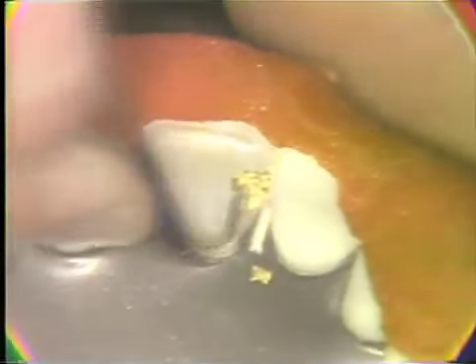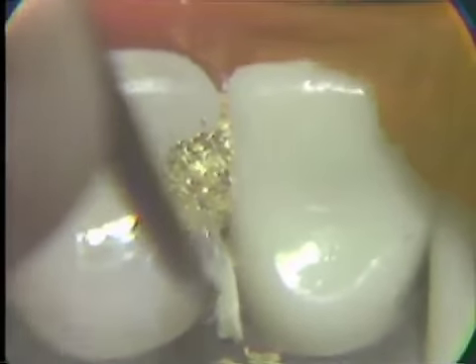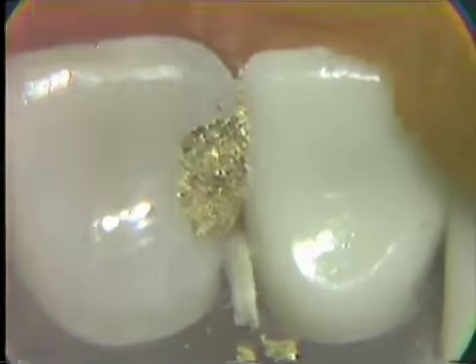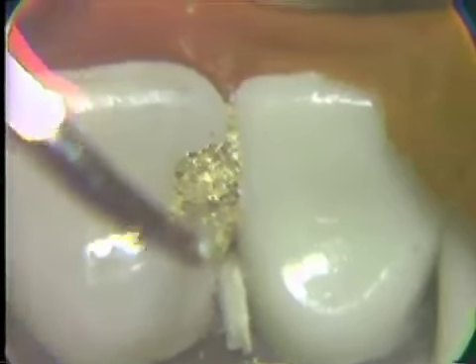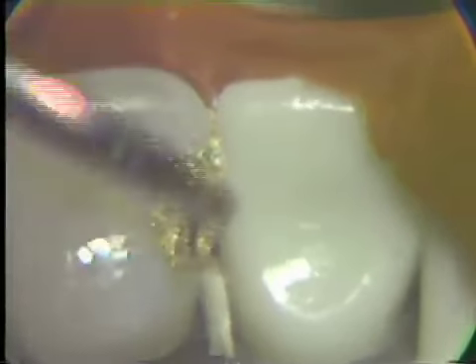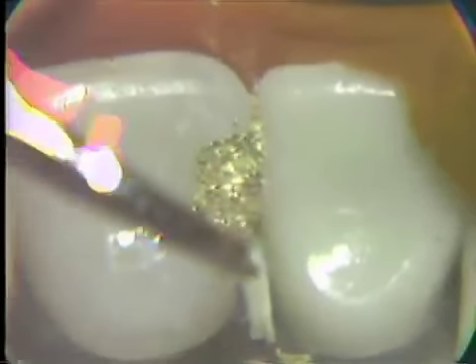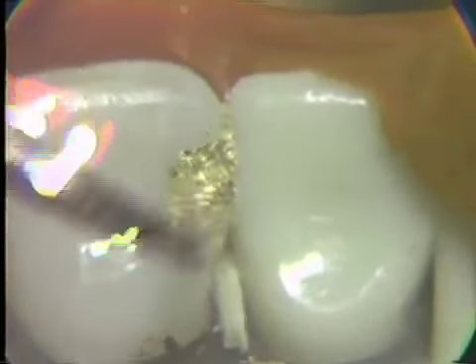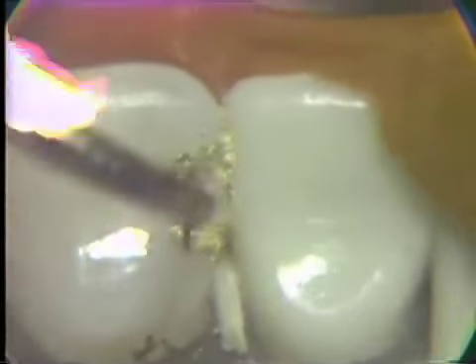Again, laying that into position, and then the condensation continuing with this rocking motion. And see too that as we have reached margin areas, we've attempted to carry through the removal of the gross excess of material so we don't have that to contend with in our finishing operation. This makes the finding of margins then more easily accomplished.